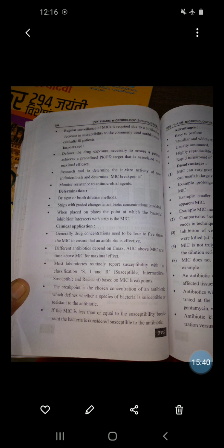Then most laboratories routinely report susceptibility with the classification that is SIR. S means susceptible, I means intermediate susceptible, and R is resistant, based on the MIC breakpoint.